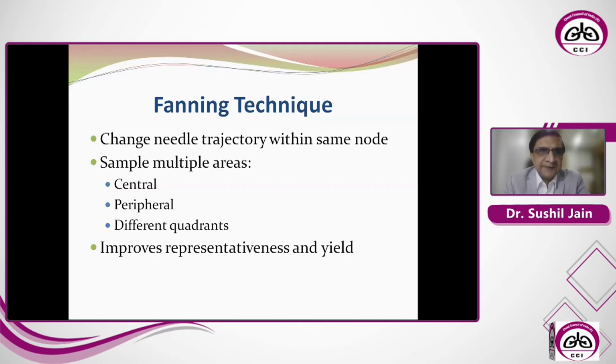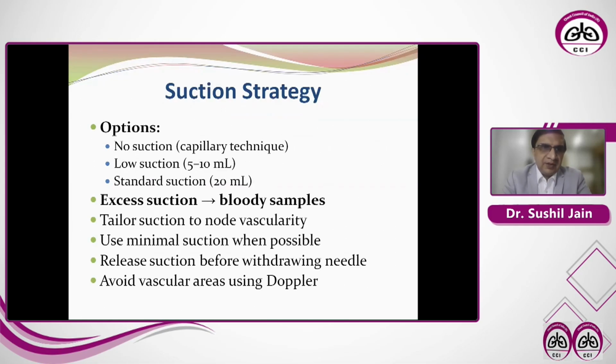Coming to suction strategy. Now, with suction, there are different schools of thought. Different people use different strategies for suction. Some people don't use suction at all. They use the capillary technique, then low suction, that is between 5 to 10 ml, or a standard suction, which is usually 20 ml. Now, excessive suction can cause bloody samples.